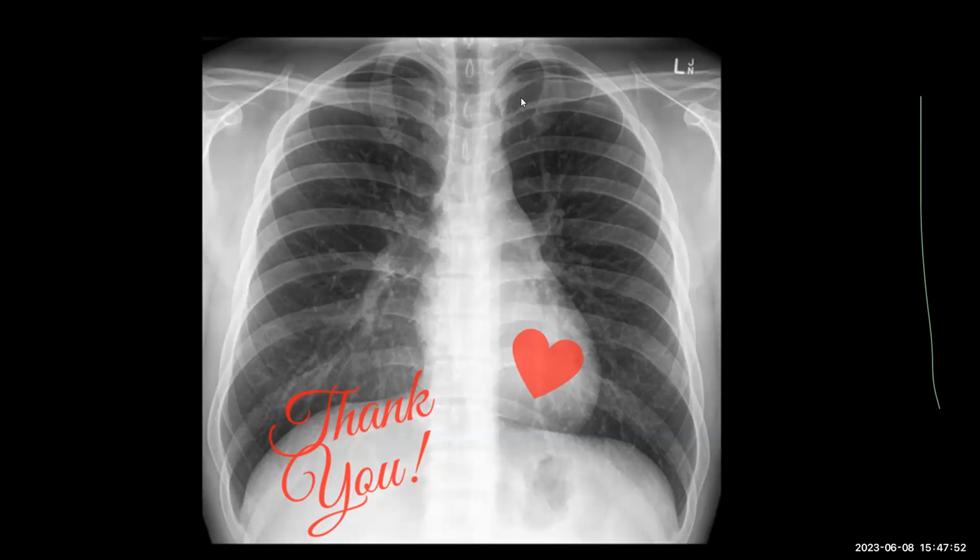And as for the second part of the question, contrast, we usually do not give contrast. In post-operative cases, it's very helpful because you have epidural fibrosis. If you want to differentiate between a disc, which could be residual or recurrent, versus epidural fibrosis, then yes, contrast is indicated, and that is the most common cause for indication of contrast. Apart from that, if you're suspecting infection or a tumor, people can give contrast, but the most common scenario is the post-operative spine, where you want to differentiate between epidural fibrosis and a residual or recurrent disc.